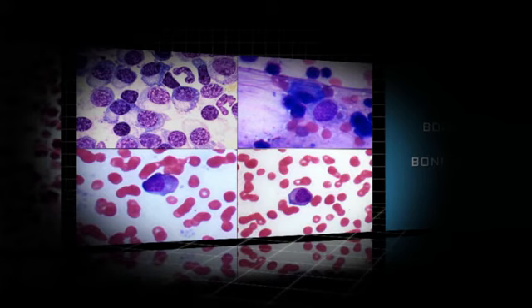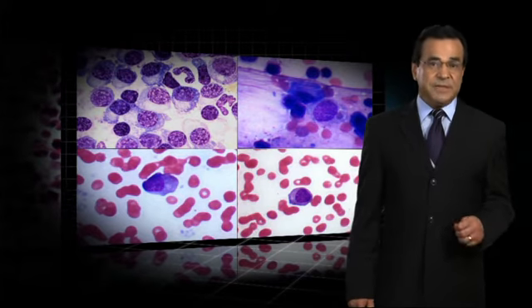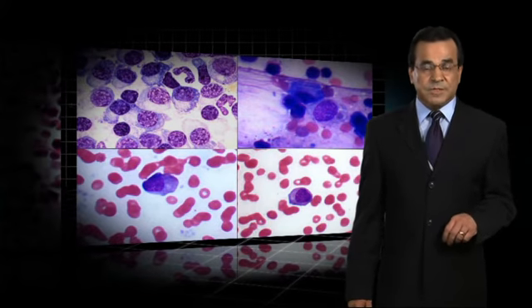The only difference in these cells is they are slightly larger in size, and more important is the monoclonality, because those cells are positive for kappa and negative for lambda, indicating these are actually monoclonal cells. In the bone marrow aspirate, there was a little discrepancy because we are not seeing in the aspirate as much as we see in the bone marrow section.